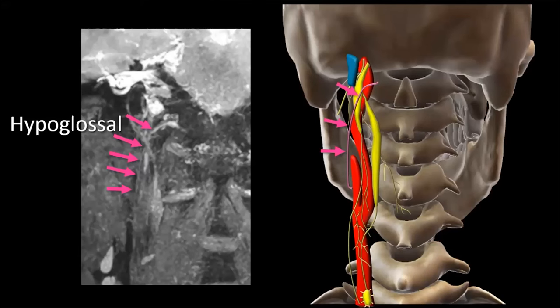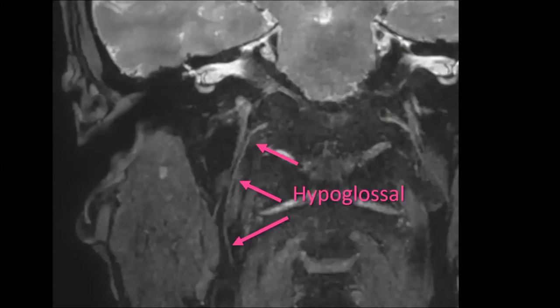We can also visualize the hypoglossal nerve. You can see here, this is where it's exiting through the hypoglossal foramen, where it swings around to join the lower cranial nerves in the carotid space before moving anteriorly to the tongue. So you can see we can take it all the way on our curved multiplanar formats from the hypoglossal canal out along around through the carotid space as it turns. And now it's going to be going kind of out of plane here into the tongue itself.